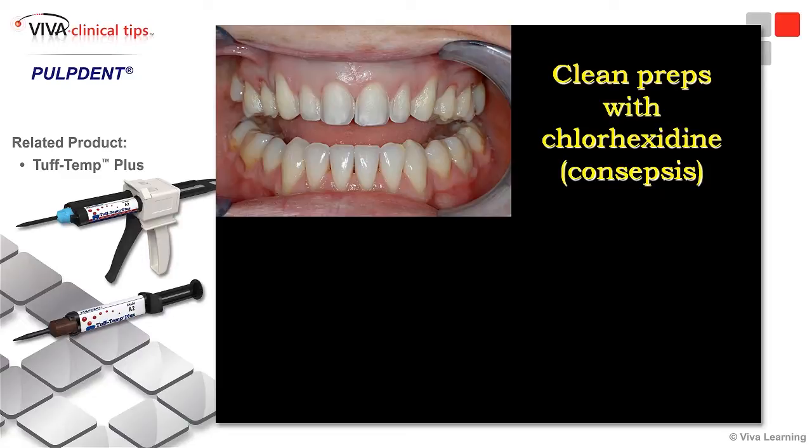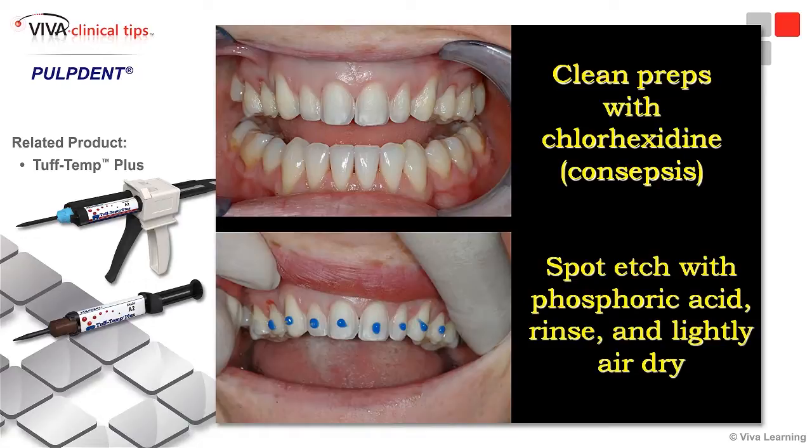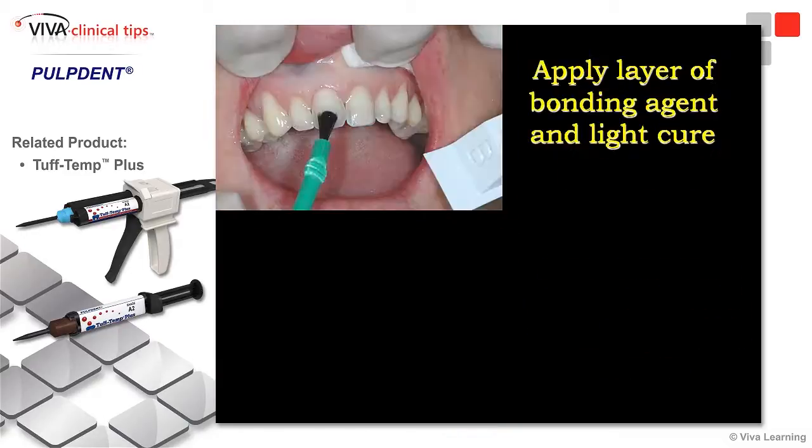We're going to clean our preps with some type of chlorhexidine rinse, and rinse this off — this antimicrobial agent — to disinfect the teeth. Then we'll go ahead and spot etch the teeth. We put a little etch of phosphoric acid gel right in the center of the tooth, allow that to sit for about 10-15 seconds, rinse that off, lightly air dry, and then we'll come back and paint those areas with some bonding agent.